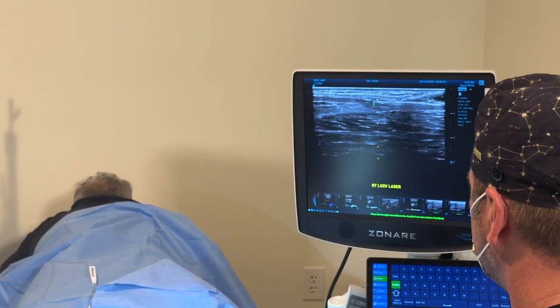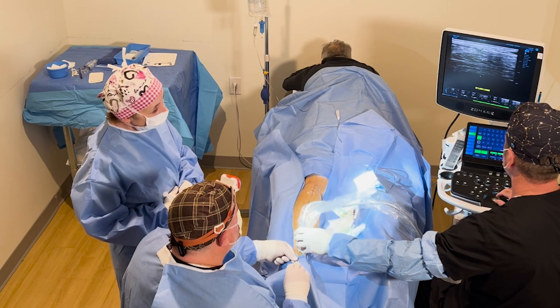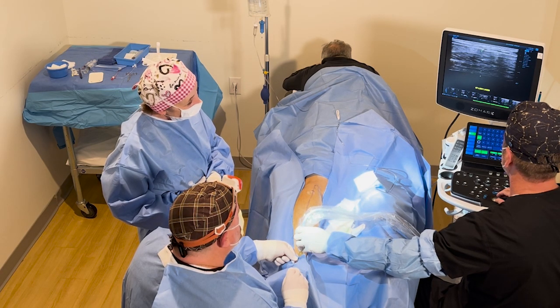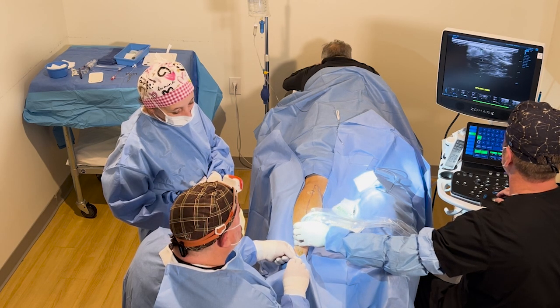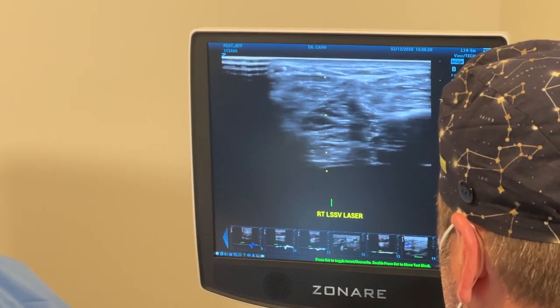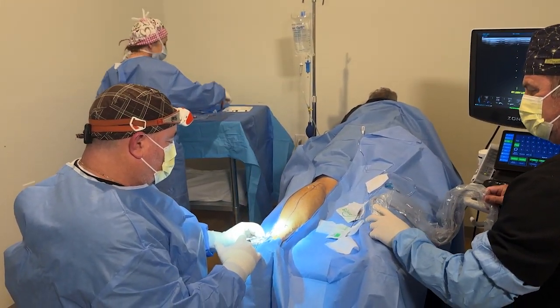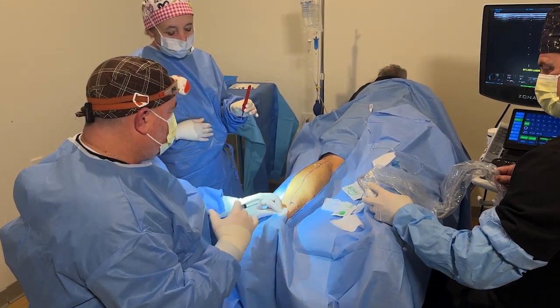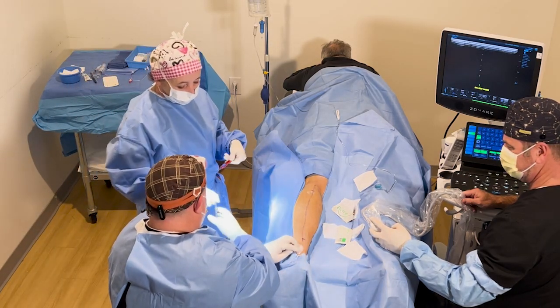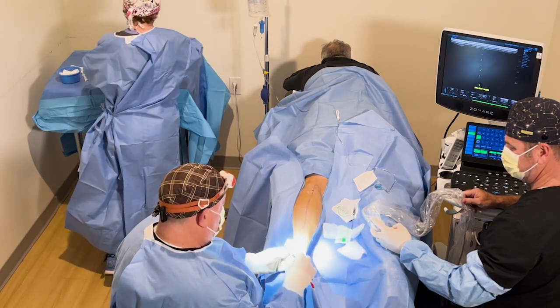You're going to see the wire going directly into the vein. You can actually see the back of the vein drop down. The white dot's inside the vein now, and that's the little guide wire directly inside the vein. So we remove our finder needle and put a little more lidocaine in to keep things comfortable. Then we make a small incision and open it up a little bit.